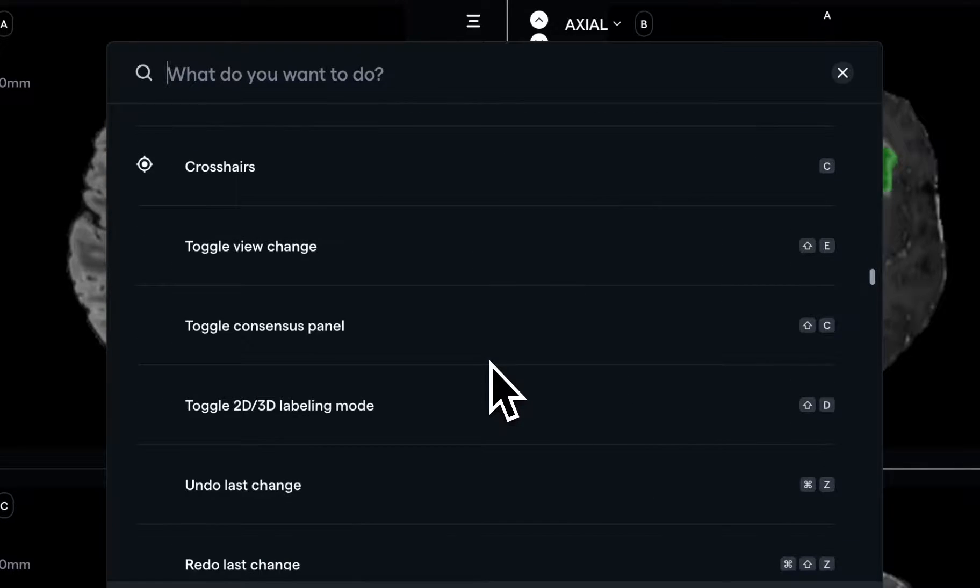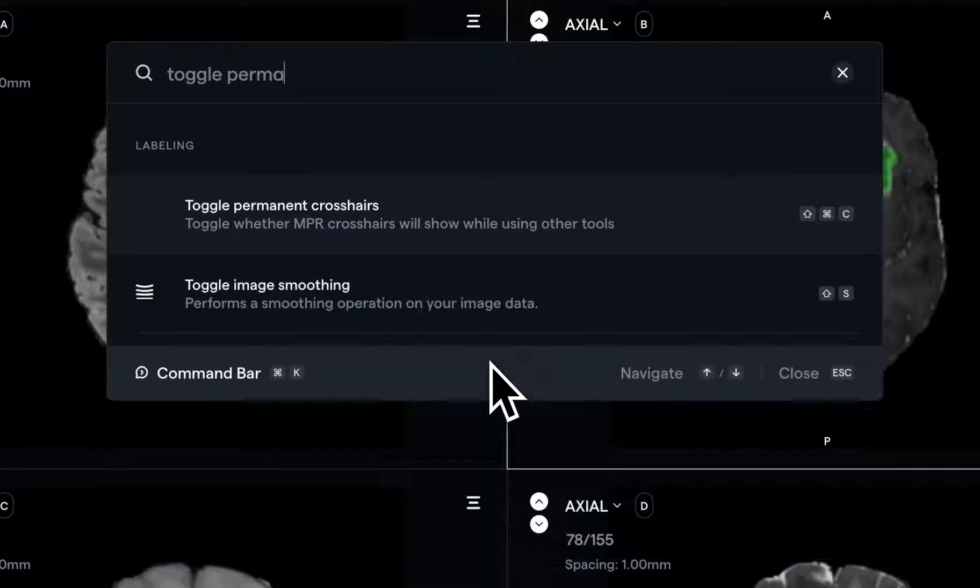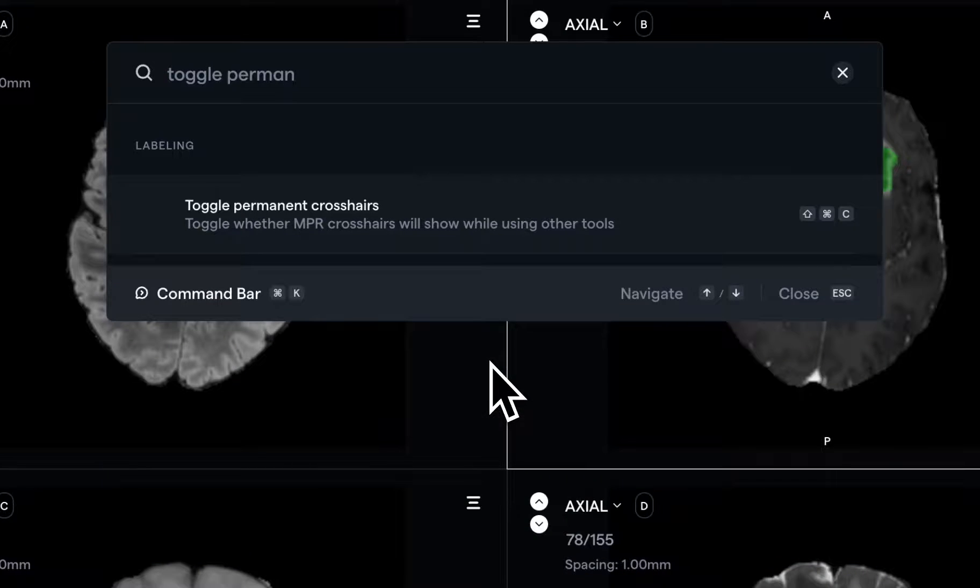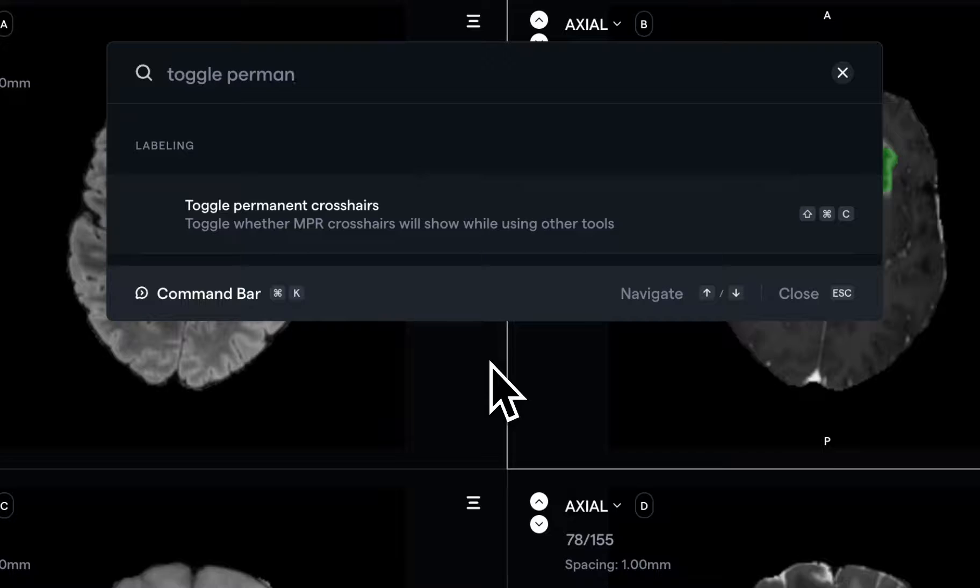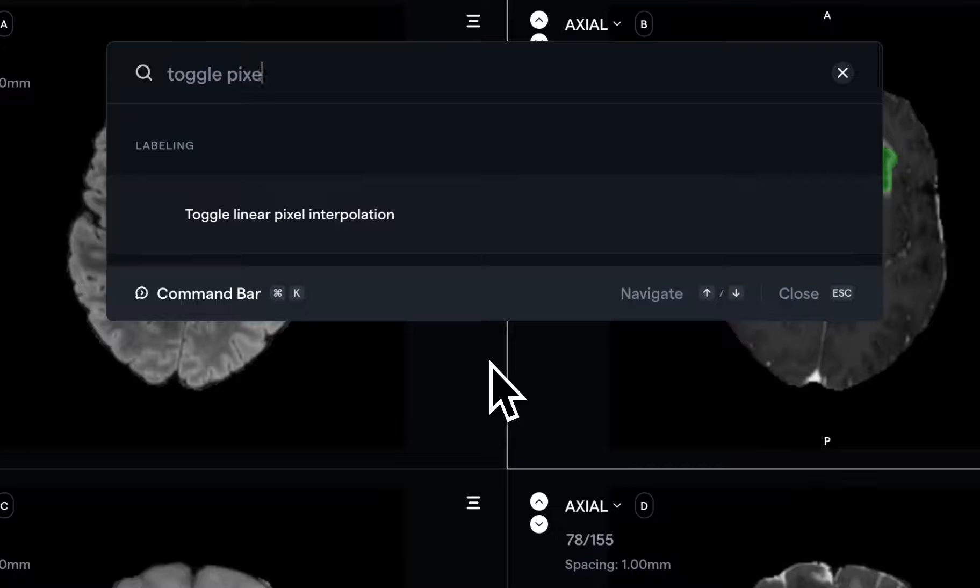Two ones that are maybe useful for your purposes are toggling permanent crosshairs, which allows you to completely disable the MPR crosshairs, if you don't have the crosshair tool selected specifically.